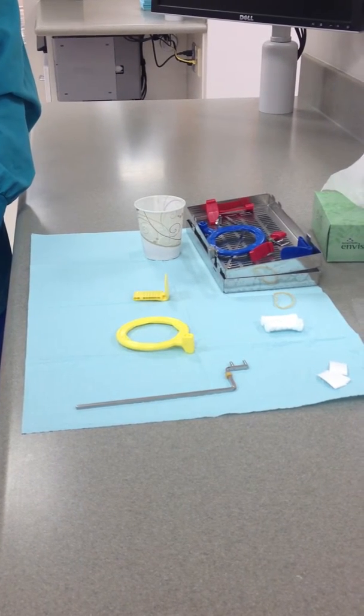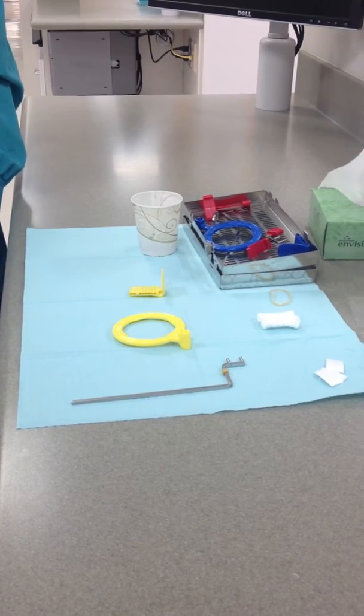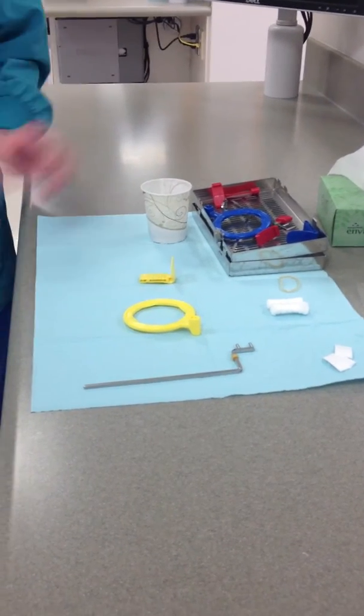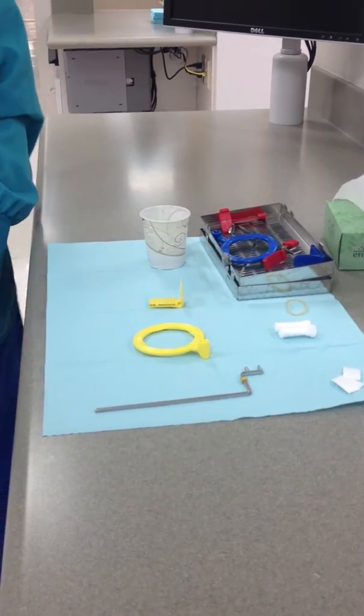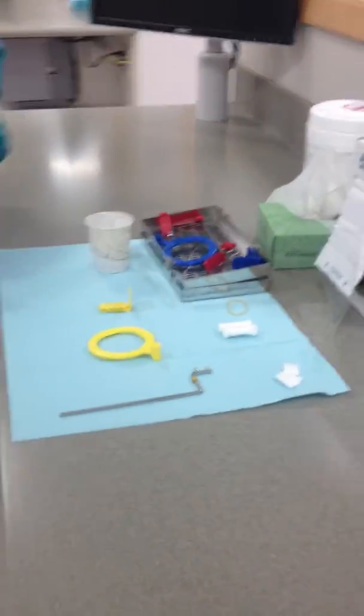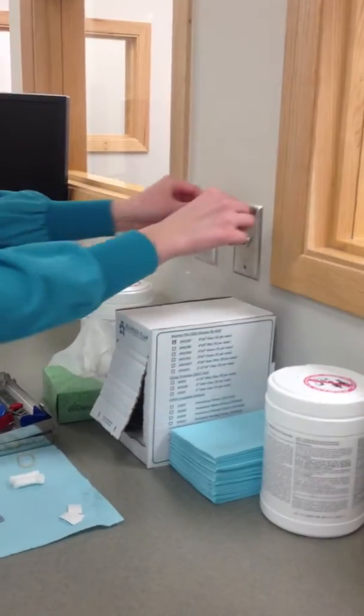Today we are going to take a radiograph of a mandibular premolar periapical. To prepare the unit, you will need to place a blue napkin on the countertop and set out a Dixie cup. Make sure that you only touch the cup with un-gloved hands. Next, cover the exposure switch with a piece of barrier tape, which you can find right under the exposure switch on the countertop.